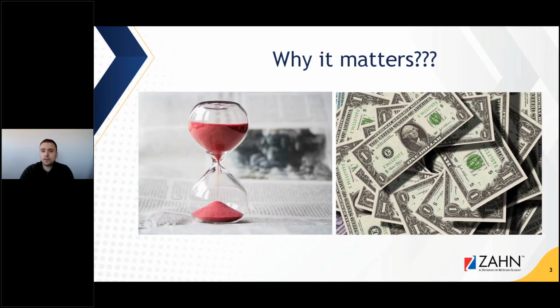So why does it matter? Nobody likes a remake. There were too many situations where the designer would sit there and spend a ton of time designing something that's incorrectly designed or didn't have enough information. It goes into production, turns out it's wrong, and you have to go back, or it gets produced, goes in the patient's mouth, and fractures after a certain amount of time. That's saving you time and money if you do it correctly, but also costing you time and money if you don't. That's the whole point of today.